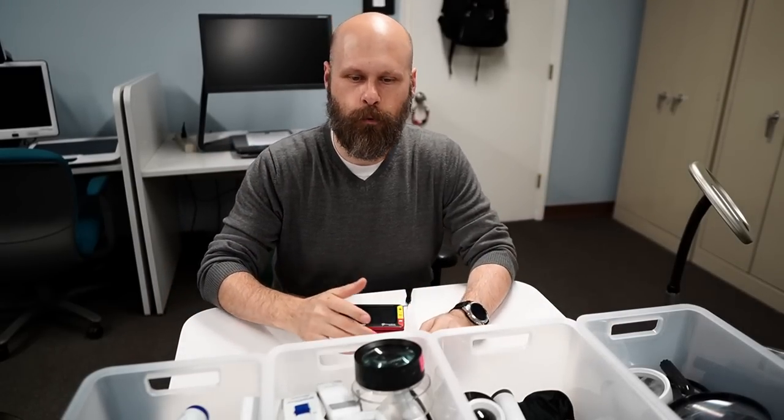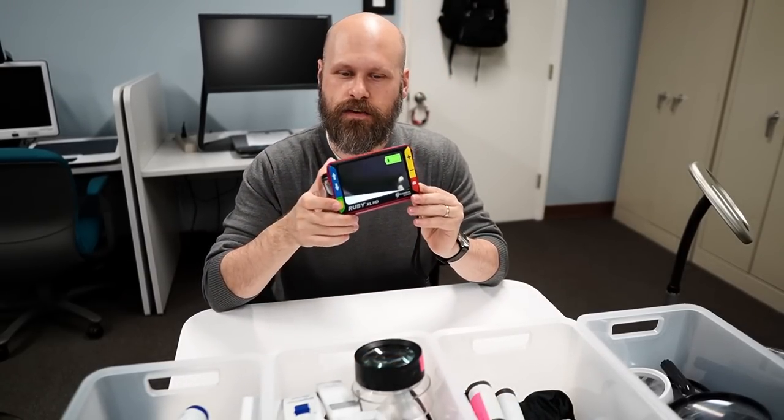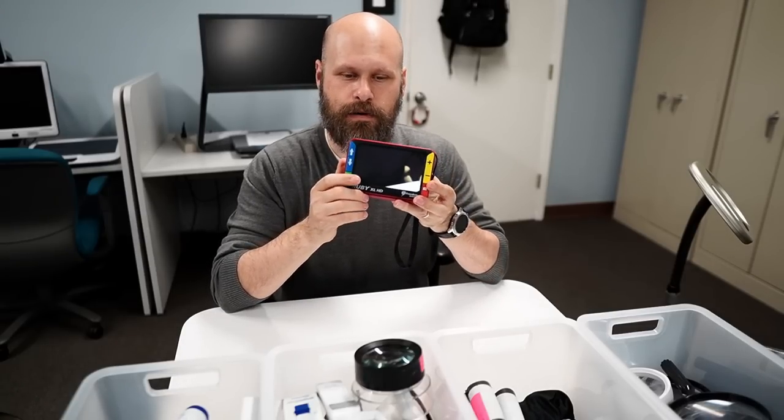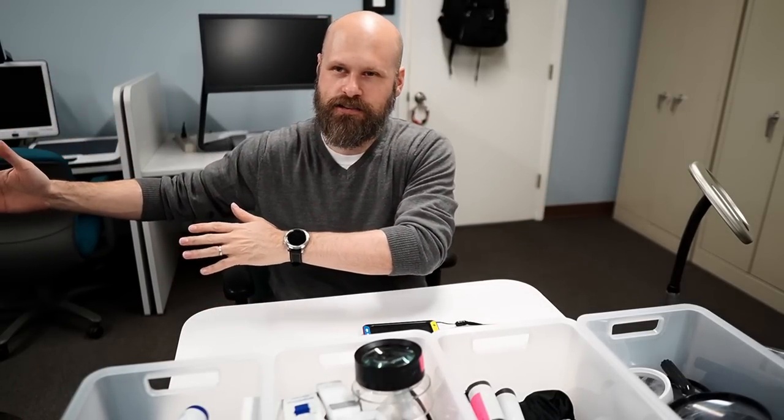If you get to the point where you cannot find a magnifier strong enough — say you need a ten times magnifier but the lens is just way too small to work with — then we recommend going towards electronic magnification. The first step would be a small portable digital magnifier. This is my Ruby; I've done a video about it before. It has a five inch screen and works really well. Generally with digital magnifiers you have a two inch, three inch, five inch, seven inch, ten inch, or twelve inch screen. The larger it gets, the less portable it tends to be, but you get a nice big screen. After size twelve, you're getting into desktop digital magnifiers — the desktop reader CCTV range.